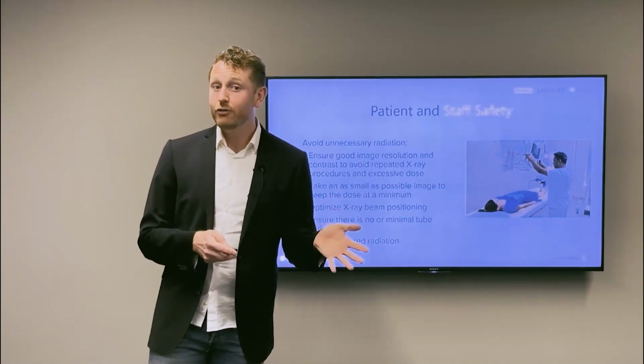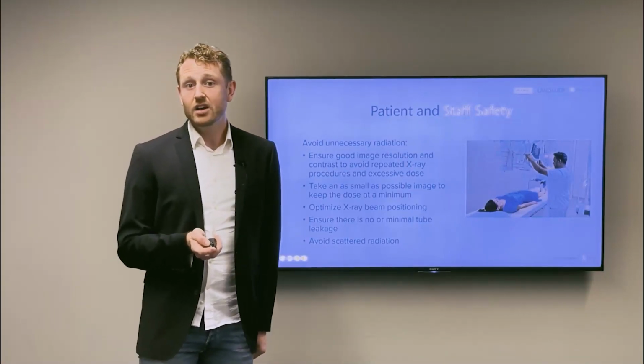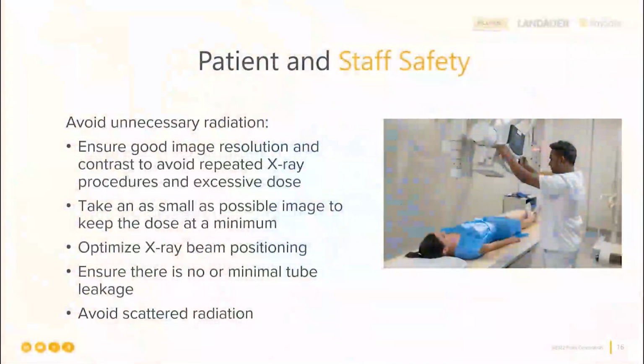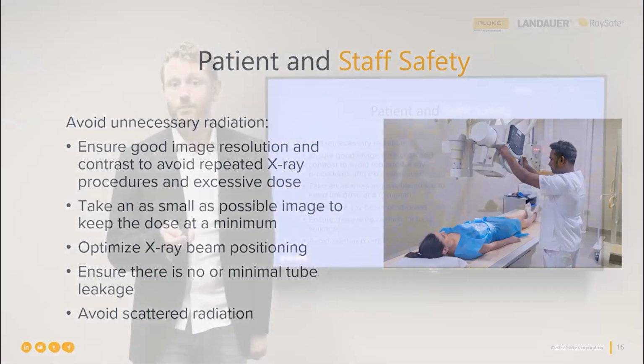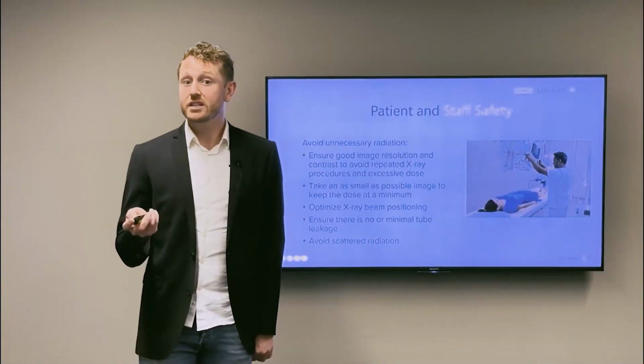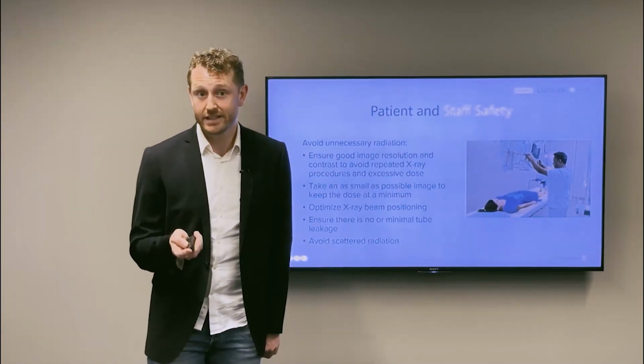Okay, we will now focus more on the safety bit of the QA testing. All these hardware problems we have discussed also affect the output of the machine, and it's crucial that the X-ray machine's operator knows the status of the machine. By knowing the status, the operator can give the correct settings to the machine, meaning a high quality picture can be taken while the dose to the patient is at its minimum, all in accordance with ALARA. If it for some reason does not give the same output as before, it may affect patient and staff safety.